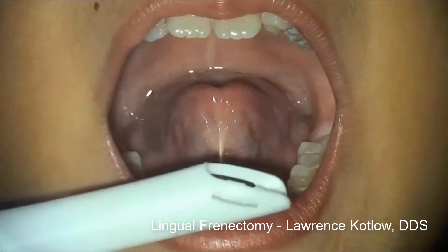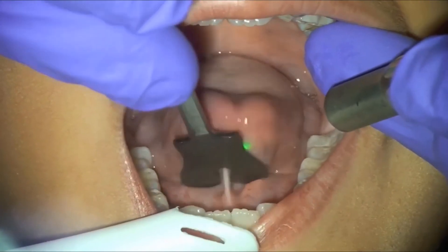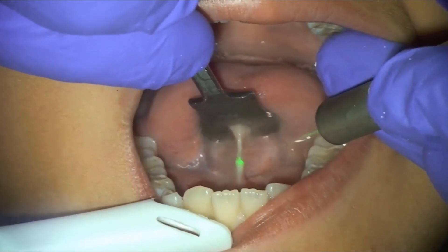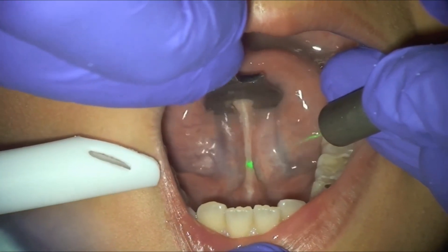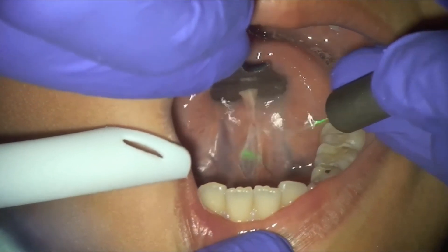The next case demonstrates how easy it is to perform frenectomies with Solea. This 8-year-old patient received no local anesthetic and no bleeding occurred during the procedure. The procedure was completed in under 20 seconds and extremely fast healing was observed. Solea enabled complete control over the procedure, yielding outstanding clinical results and delivering an amazing patient experience.